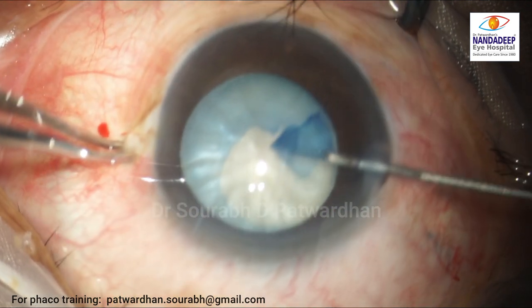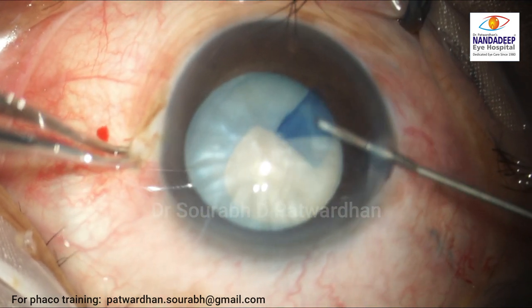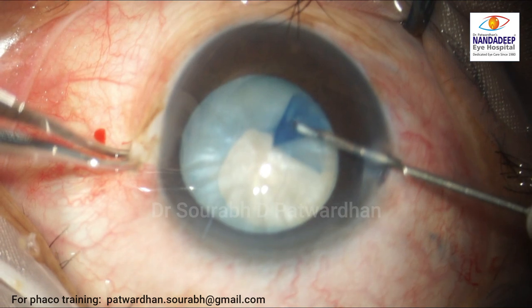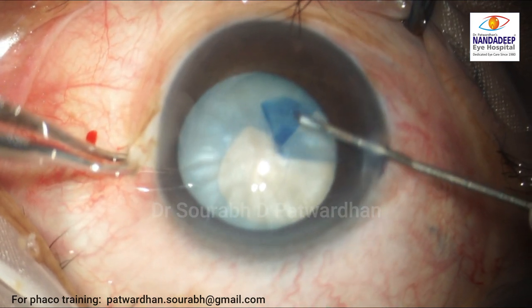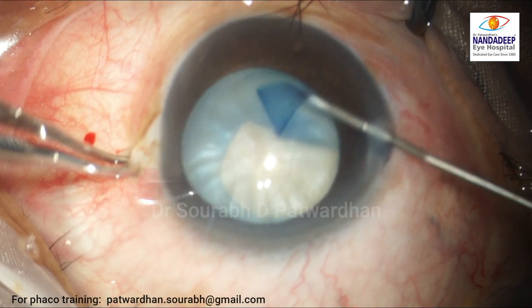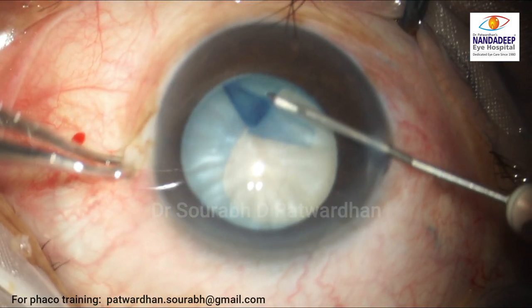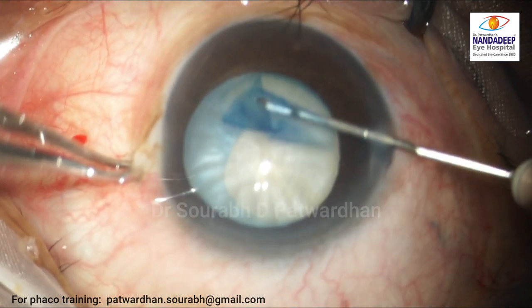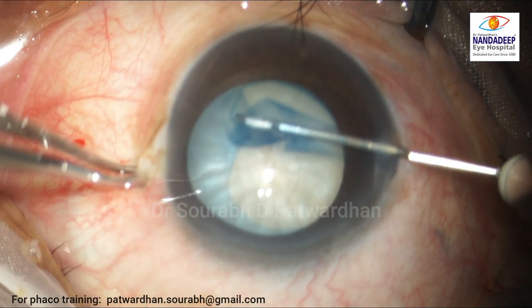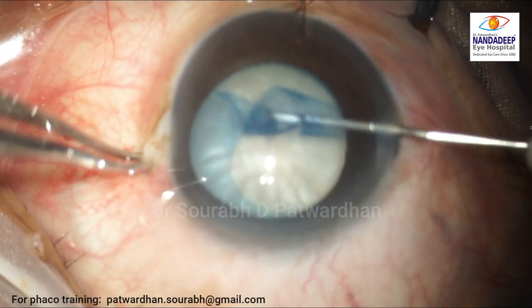The surgeon maneuvers into the sub-incisional area, which is the toughest to maneuver. Very steady hands from this experienced surgeon — no tremor, no hesitation — which are extremely good points. You can see the margin has come back to where it should be, and the surgeon is relieved, but only for a moment.